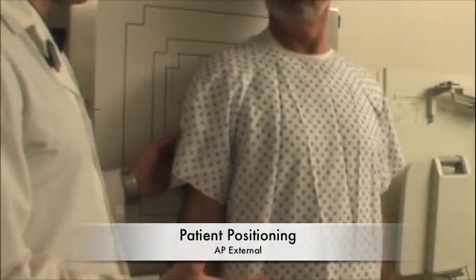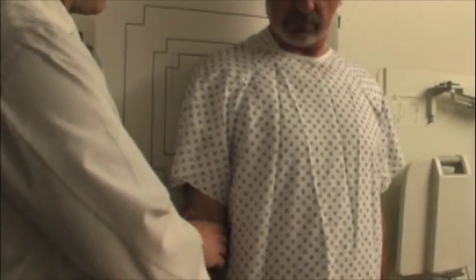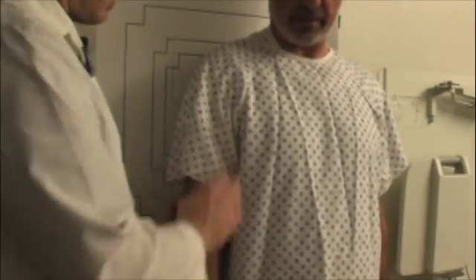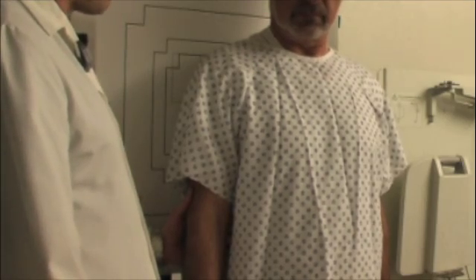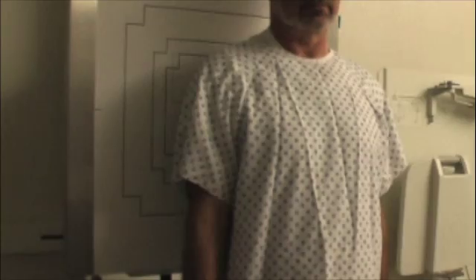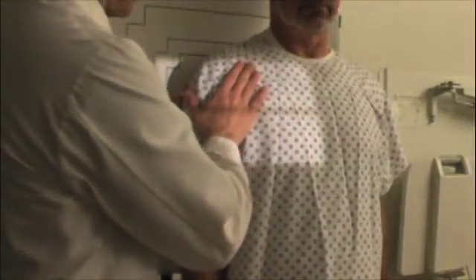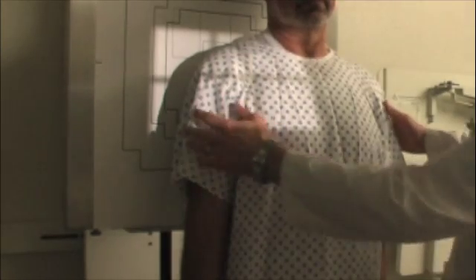All right, Mr. Smith. So like I said, we're going to be taking some x-rays of the shoulder. What I'm going to have you do is stay just like how you are, and we're going to do a couple of them with your arm in different positions — just to demonstrate the joint in a little bit different way. Then I'll have you do one where we're going to be facing the board, and I'll give you more instructions when we get there. Let me turn my light on, and I'll be lightly pressing on you again here.